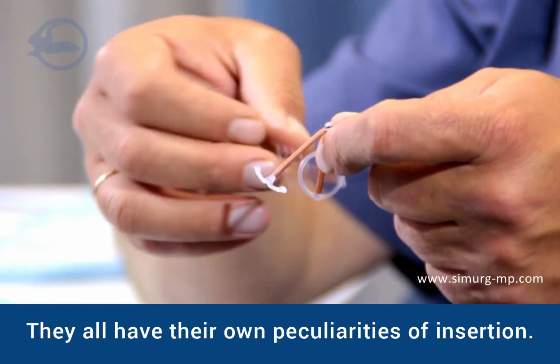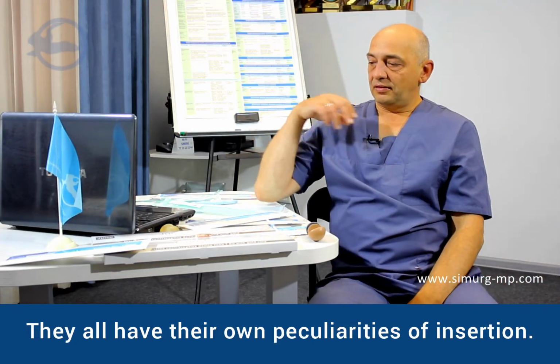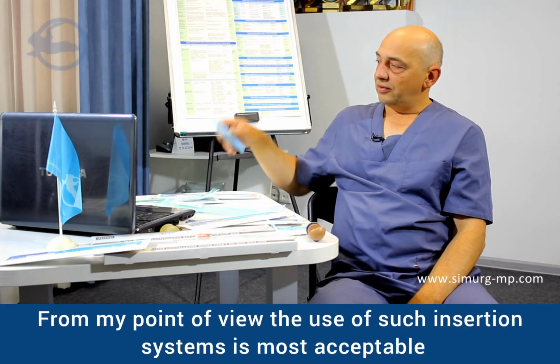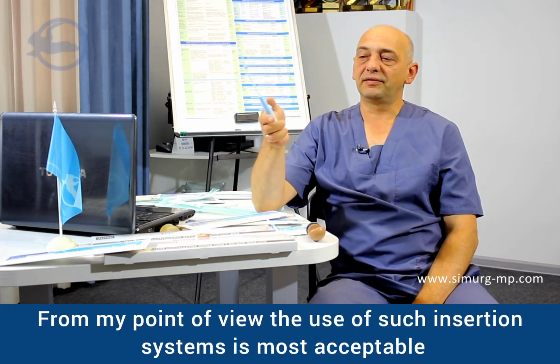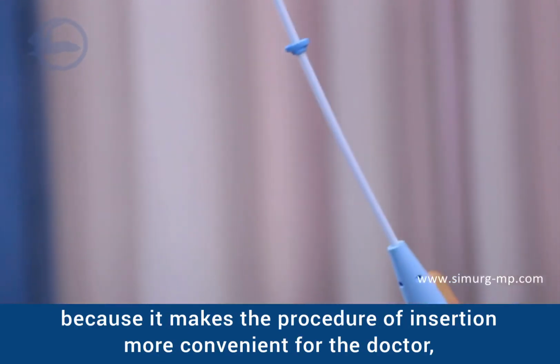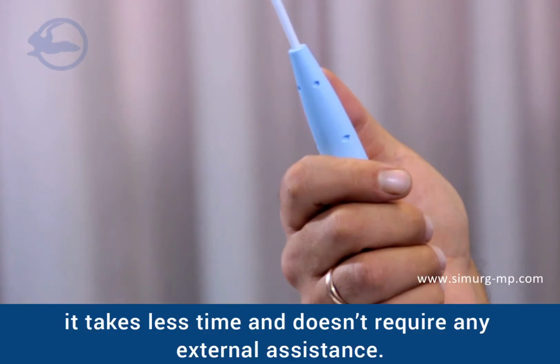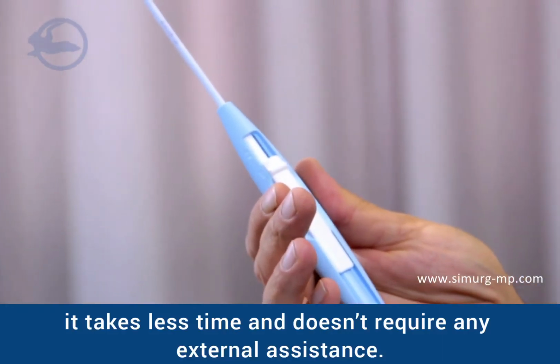peculiarities of insertion. From my point of view, the use of such an insertion system is most acceptable, because it makes the procedure of insertion more convenient for the doctor. It takes less time and doesn't require any external assistance.